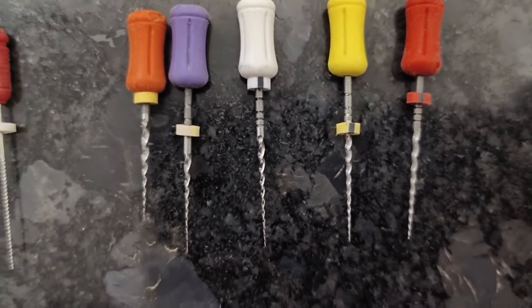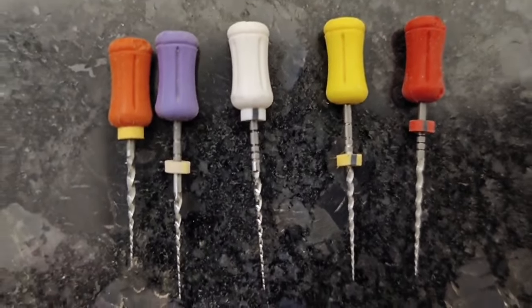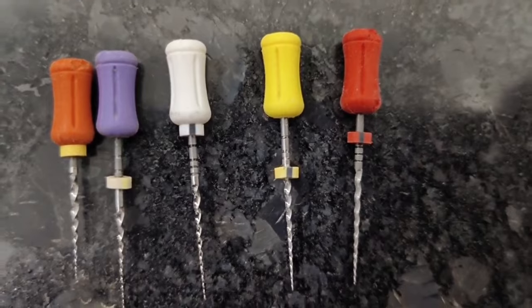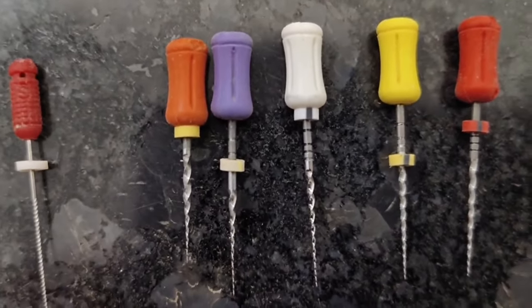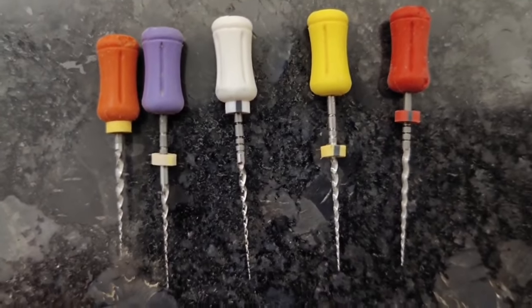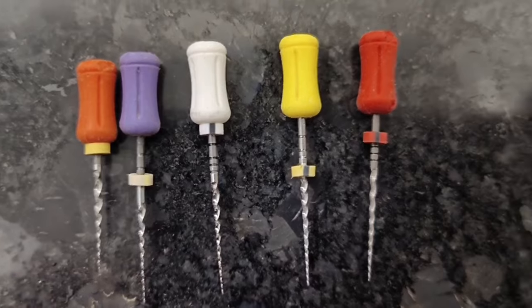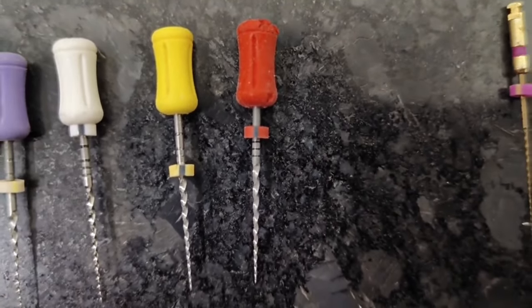Moving on to the ProTaper file system. So the first orange file is the SX, purple is S1, white is S2, yellow is F1, and the red one is F2. So SX is the coronal flaring file, that is, it's short in length. And the first two files, the purple and white ones, are the shaping files. And the yellow and the red ones are the finishing files.